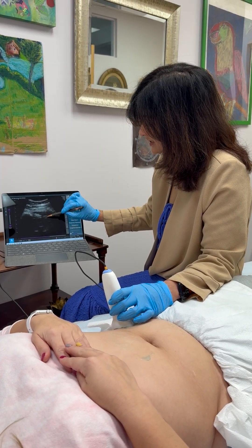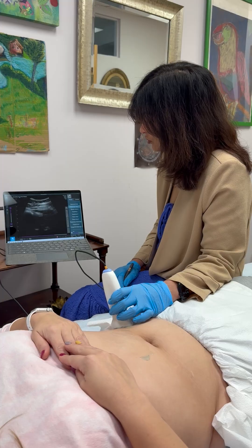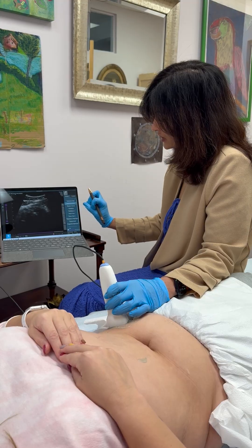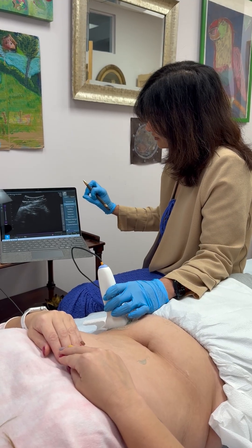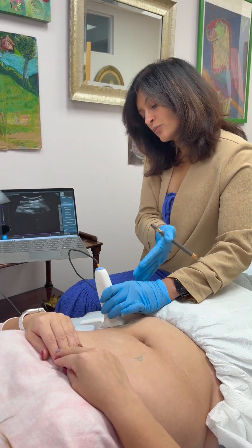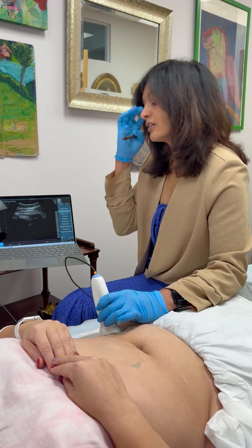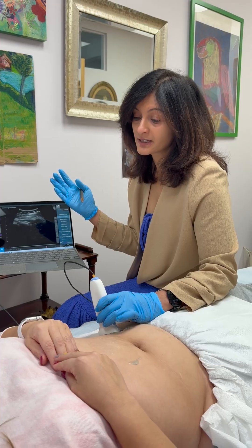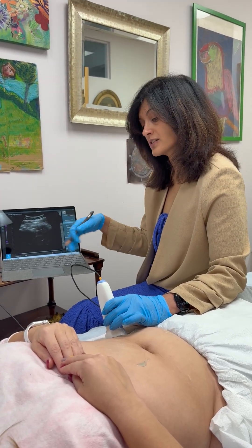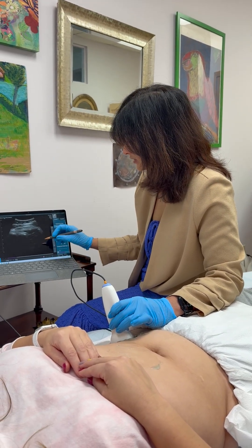Right now if I measure this, it does seem to be less than half. But if I ask you to do a core contraction — squeeze your core, whatever that means to you — what we saw is this whole muscle kind of dragged down, then let go and went back to normal. Your TA is corseting — it moves to the side of the abdomen, and that's the deep layer of muscle we want to activate. A lot of people get back pain when exercising because they don't recruit the right muscle; they work obliques and superficial muscles, and the inner muscle that really stabilizes you doesn't kick in.